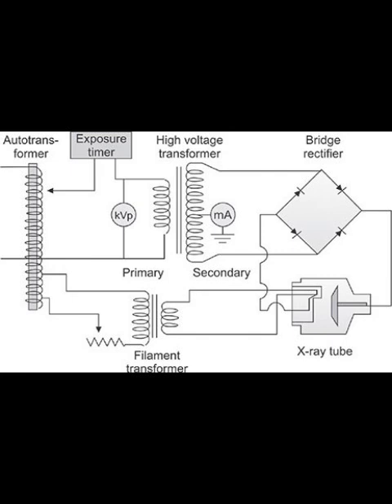We all kind of know AC, alternating current, from our wall sockets. Right, back and forth. And DC, direct current, from batteries. Simple enough. But for an X-ray machine, this isn't just theory, is it? It's like the foundational problem we need to solve right from the get-go. Oh, absolutely. So why is that distinction between oscillating AC and steady DC so absolutely critical for making X-rays?